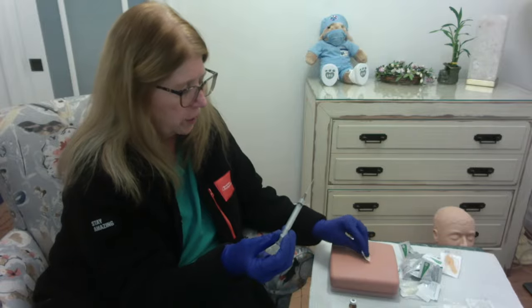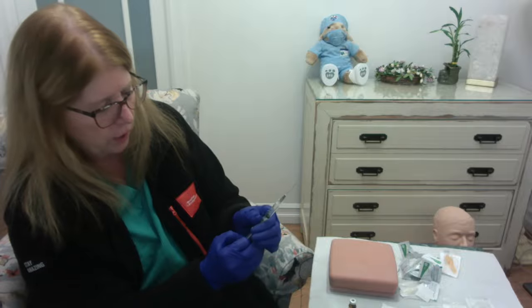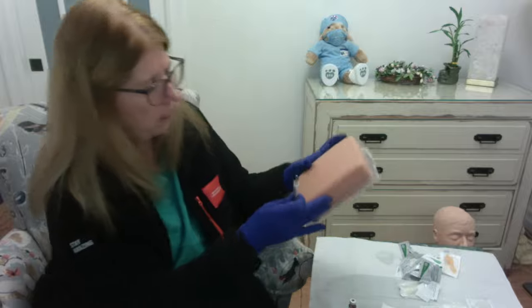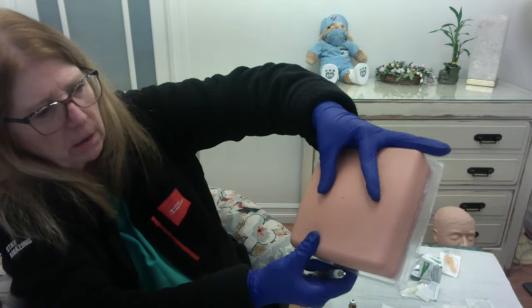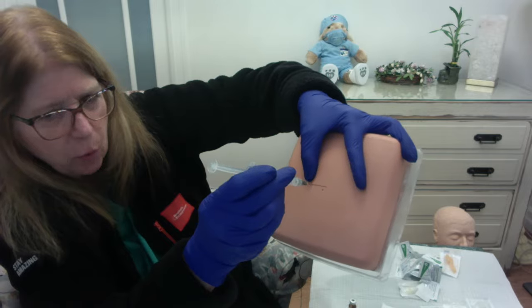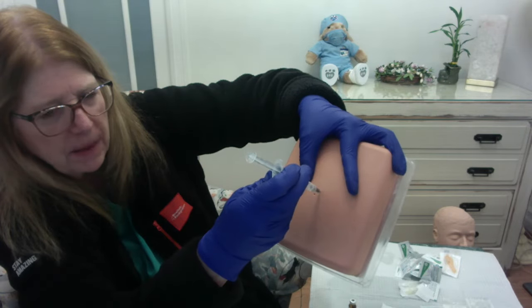Now, let me come closer to the screen to show you this one first, and then I'm going to show you something called the Z-track method. Okay, so I've cleaned the skin. I'm spreading the skin, okay? And I'm going in at 90 degrees. 1, 2, 3, in. I'm keeping that syringe steady.